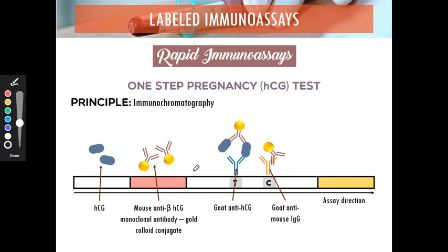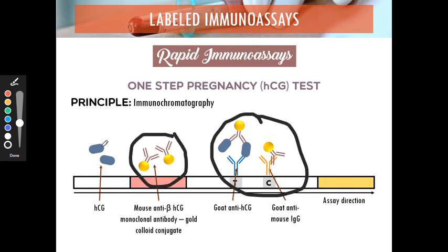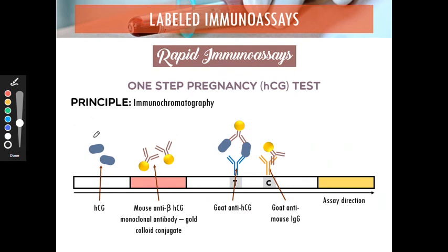All right, but again, the reagents here would depend on what you detect. Let's say if you are detecting antibody, let's say antibody to HIV or antibody to COVID, then what is here would be antigen this time, and what is used to capture could also be antigen. So it differs, depending on what you detect and also on the manufacturer. Recall the insert, the paper included in the test kits in our lab activity videos.